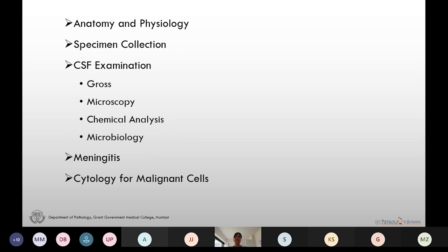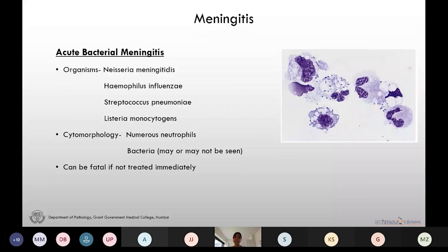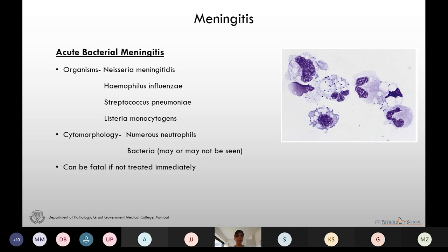Acute bacterial meningitis is caused by various organisms including Neisseria meningitidis, Haemophilus influenzae, Streptococcus pneumoniae, and Listeria monocytogenes. On the smear we see numerous neutrophils and bacteria may or may not be seen. It is very important to diagnose acute bacterial meningitis because if not treated it can turn very fatal.